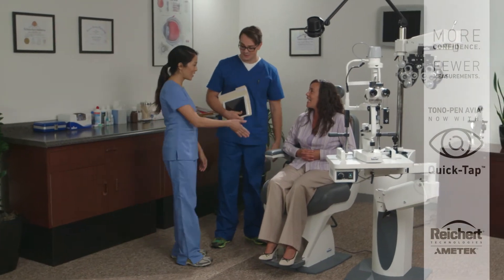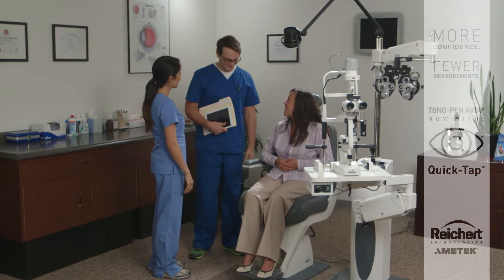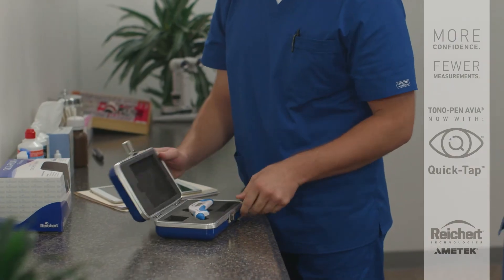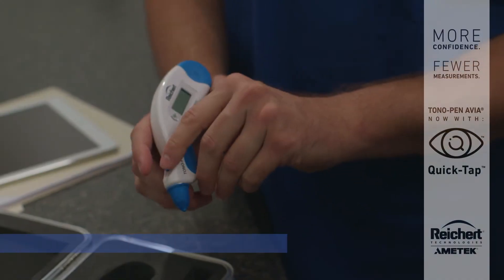Amy is having first-day jitters. She's just started at Dr. Green's practice getting on-the-job training, and she's feeling a bit overwhelmed. However, her nerves quickly begin to subside as Eric starts to demonstrate how to use Riker's Tonopan Avia.